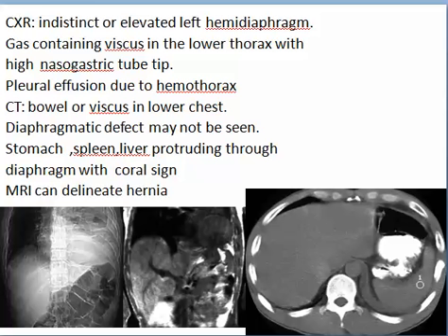Another sign for ruptured diaphragm is the incomplete crus, or thickening of the crus, or a muffling of the crus. This should be considered as another sign. Thank you.